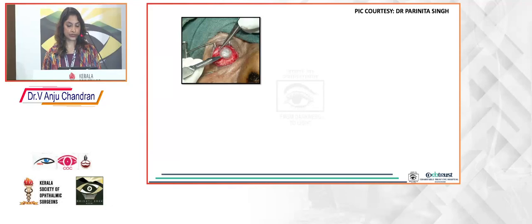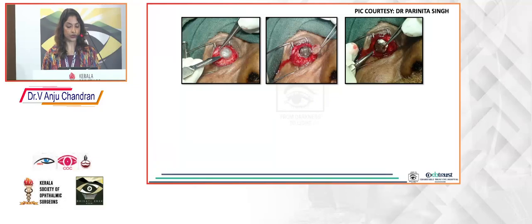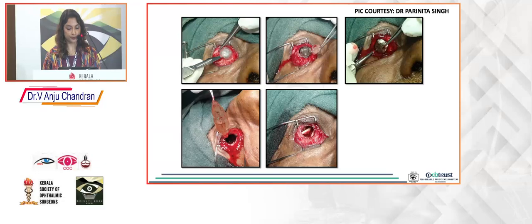So this is a step-by-step pictorial representation. So steps are more or less the same in the beginning, where you take a 360-degree conjunctival peritomy. After that, a stab incision is made into the cornea, and whereby the cornea button is then taken out. Then with the help of an evisceration scoop, you can scoop out all the contents. And it is very important to make sure that you have devitalized the uveal tissues, so make use of alcohol swabs and wash them thoroughly without touching the rest of the tissues outside.